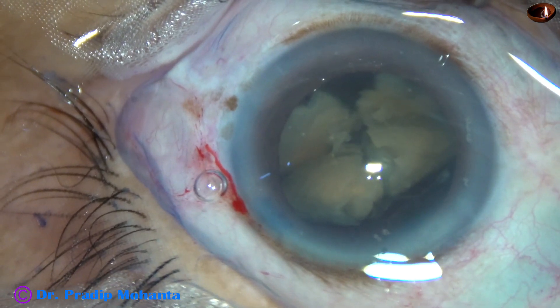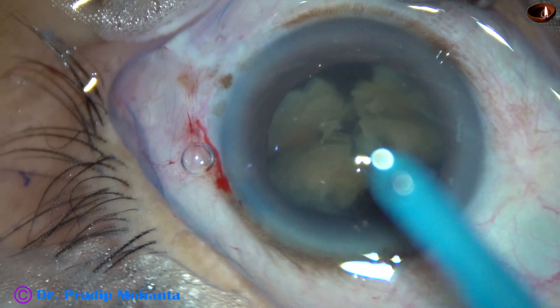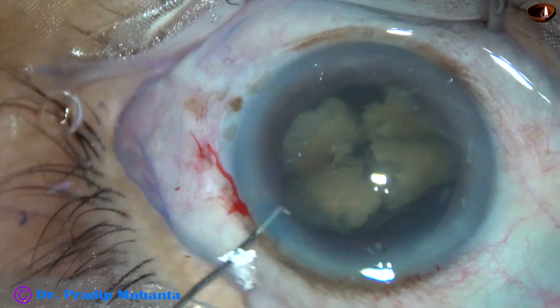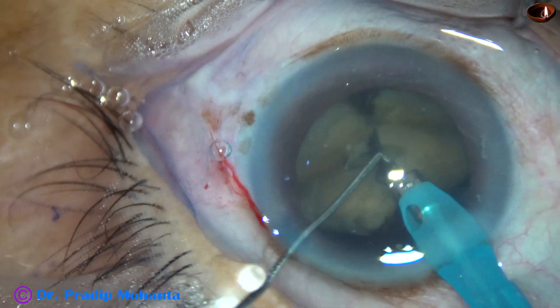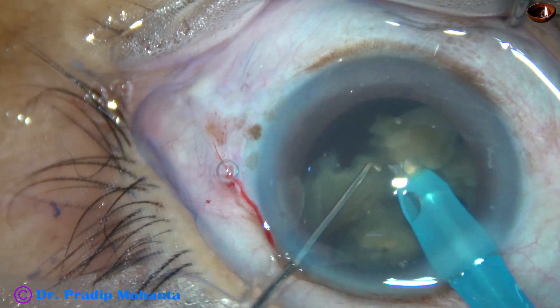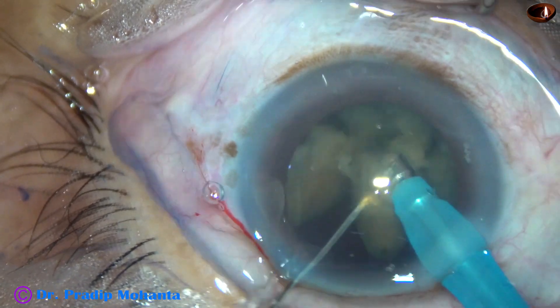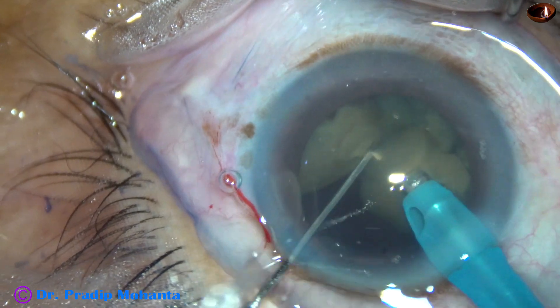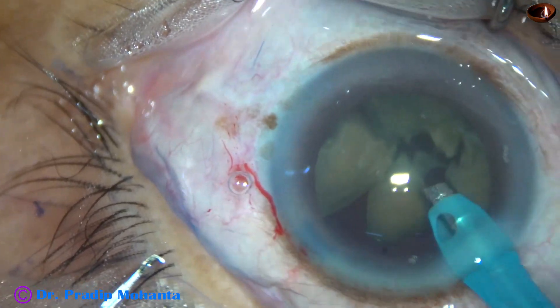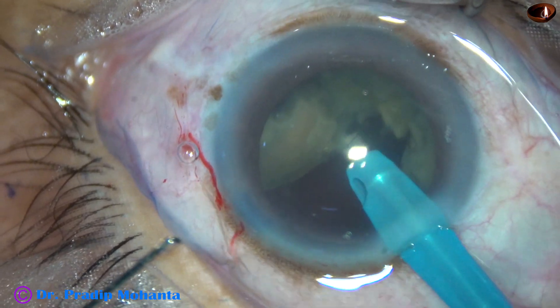I inject some more viscoelastic and go again with the FACO handpiece. The FACO handpiece goes below the lens and I start emulsifying the pieces — the free fragments. I find that the posterior capsule is not coming forward, but still I am very much careful in this case. And I have already decided to use an IOL as scaffold for emulsification of the last nuclear piece.